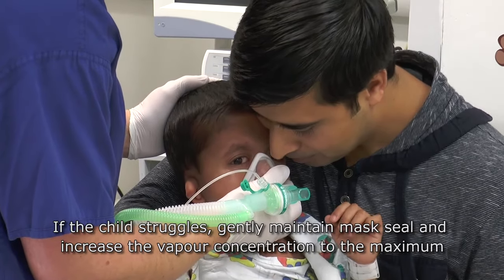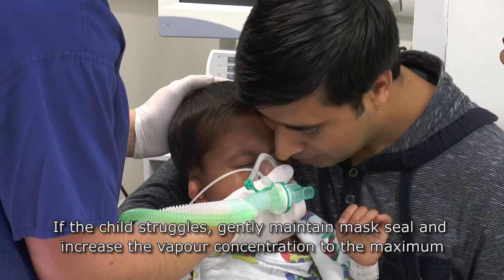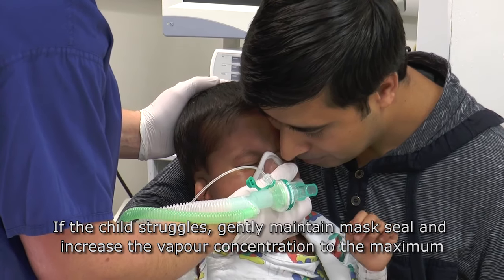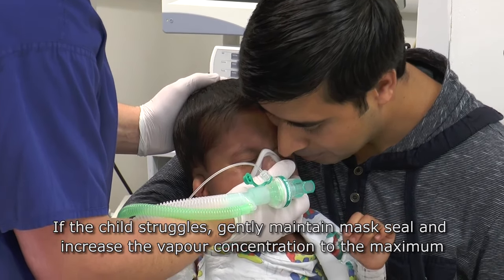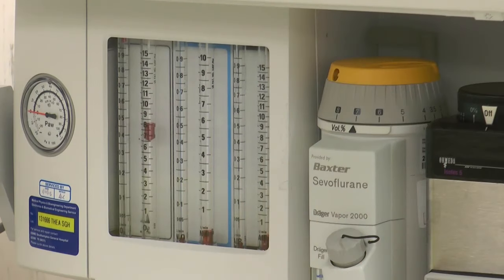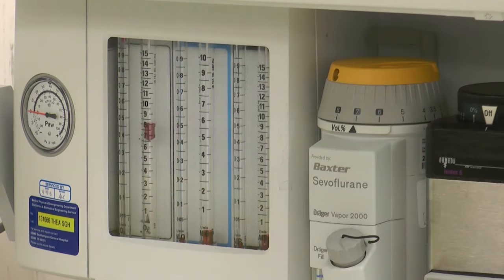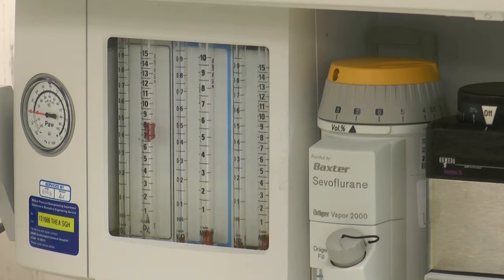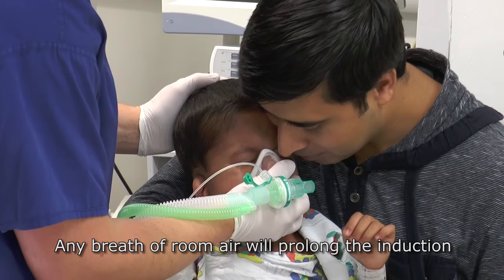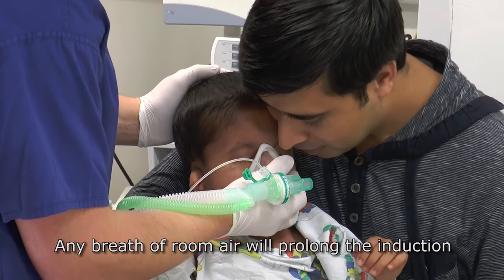If the child struggles, gently maintain mask seal and increase the vapour concentration to the maximum. Any breath of room air will prolong the induction.